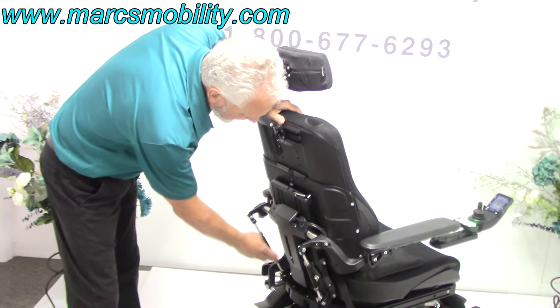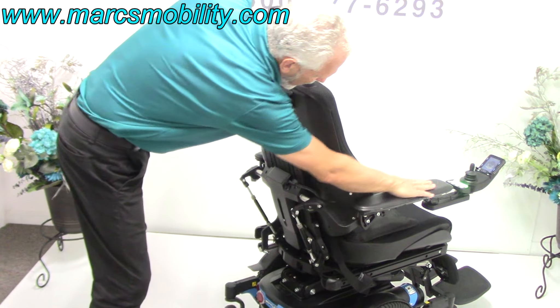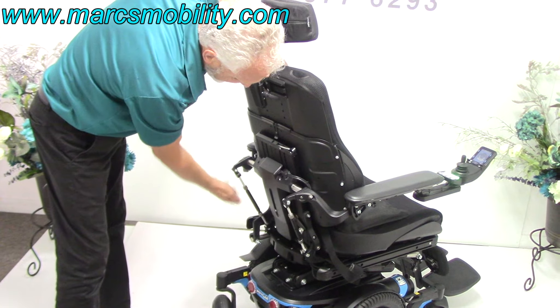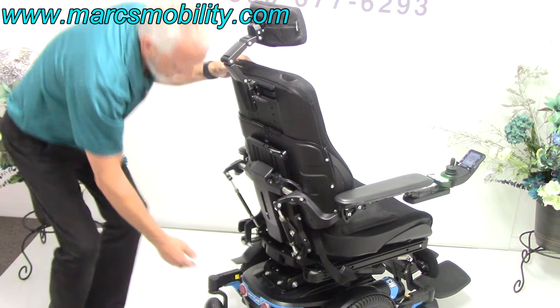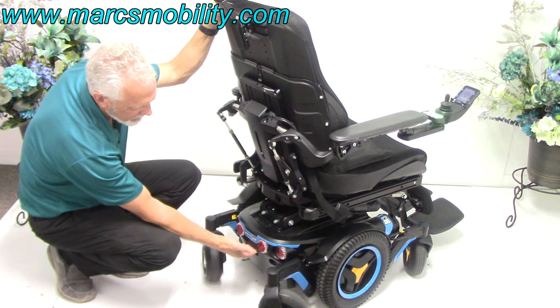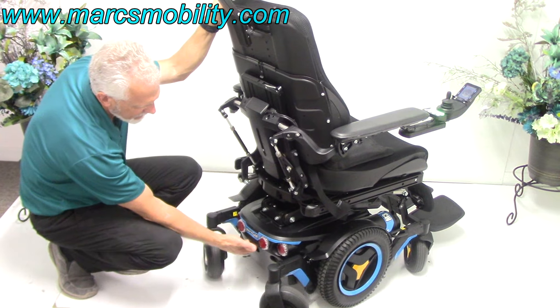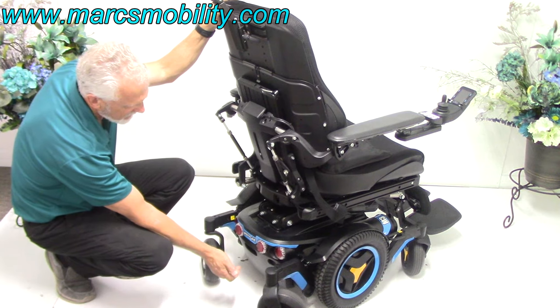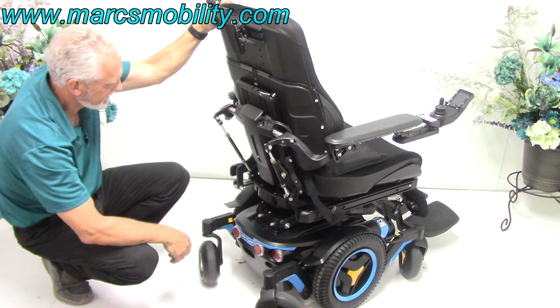You've got adjustment cylinders here and here to adjust the tilt of the arms. If you want the arm higher, you turn these cylinders — this one for the right side and this one for the left side. There's a power button here, which is where we turn the power off when we ship these chairs. You turn the power off, and then you'd turn it back on at the joystick.